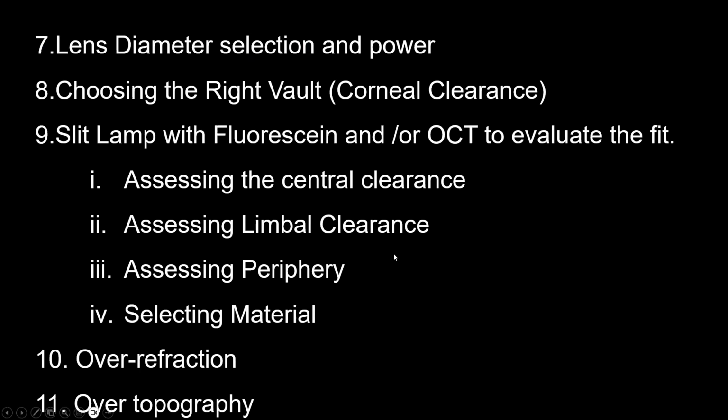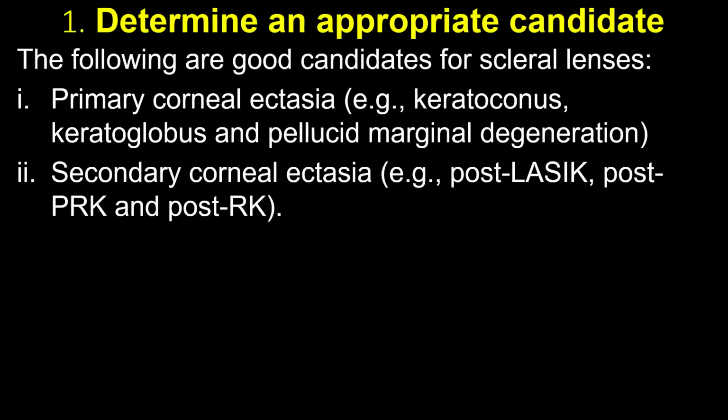And selecting the material you want based on the Dk value and all of that. Over refraction is more important than the refraction itself, because in the over refraction, the tear layer is being factored in, and other things are also coming into place. So you need to do the over refraction properly to be sure that the final prescription you give the patient is something that can fit the patient for what they want. Over topography is also very important at the end. So determine the patient for it.